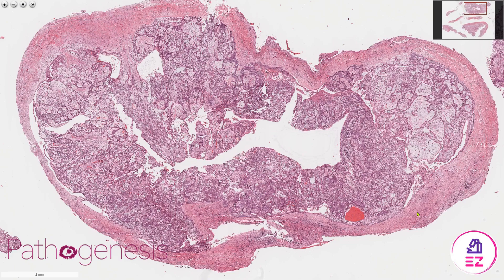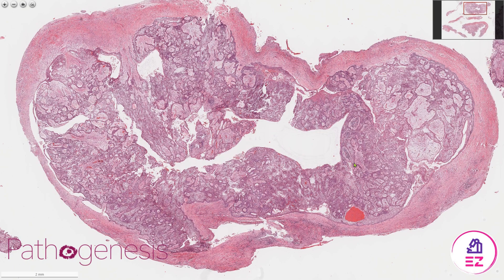We can see that this particular ameloblastoma is contained within a single cyst with a well-developed fibrous wall, hence why it's unicystic. There's no proliferation of this epithelium into the cyst wall and there are no separate islands infiltrating the surrounding bone or tissues.